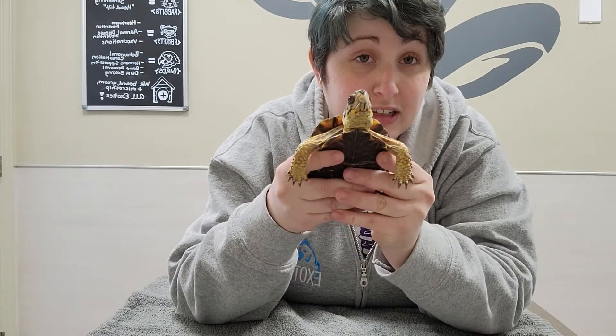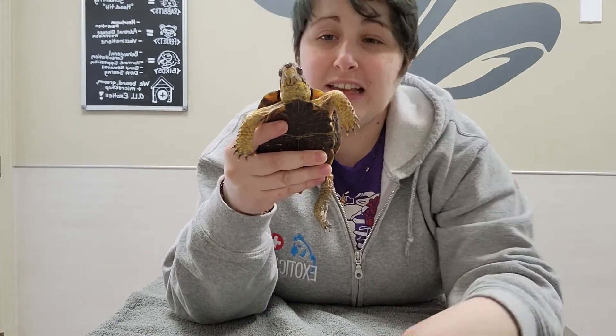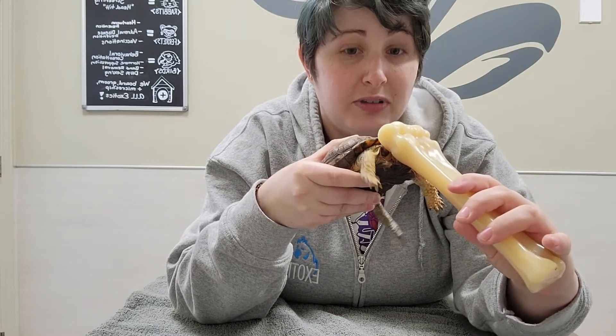We have our friend here ready to work with us and our injection already prepared. Just in case he gets snappy, we have something to block his noggin while we're giving the injection.